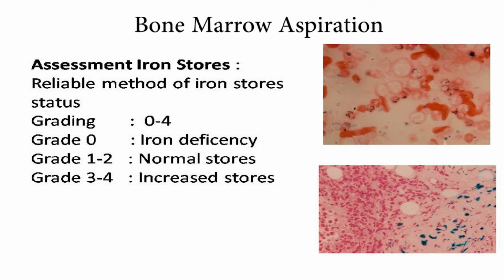Again, bone marrow assessment. I don't talk about this much, but it is particularly important not in leukemias and others, but in myelodysplastic syndrome, particularly to show the sideroblasts as they are seen here, and in anemias. Now, two things I have mostly realized. In megaloblastic anemia, the patient has macrocytes, the MCV is going to 112, 120.